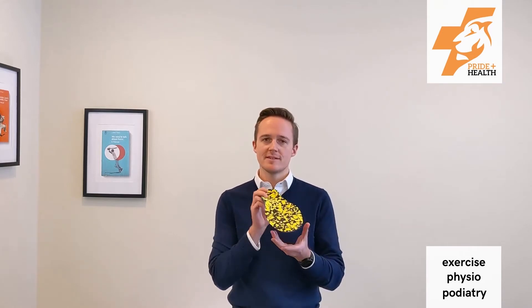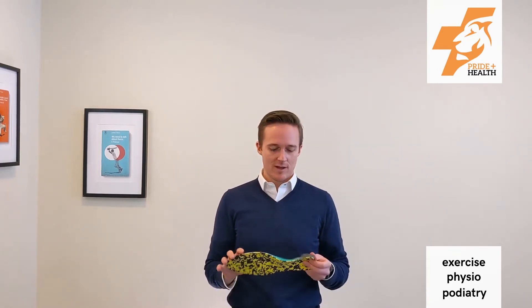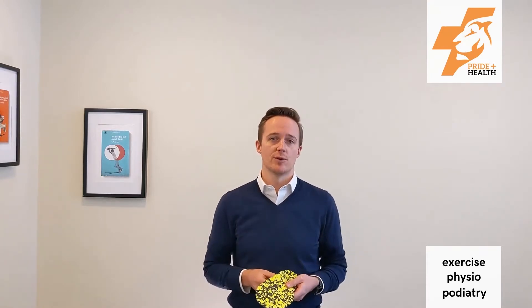Orthotics — they're these nifty little devices that us podiatrists pop inside shoes to help treat injury and various things that can go on with the foot and the lower leg. An orthotic is something that sits inside a shoe, made out of various materials, and they work by gently pushing on the foot where you would usually find muscles provide a pulling force.